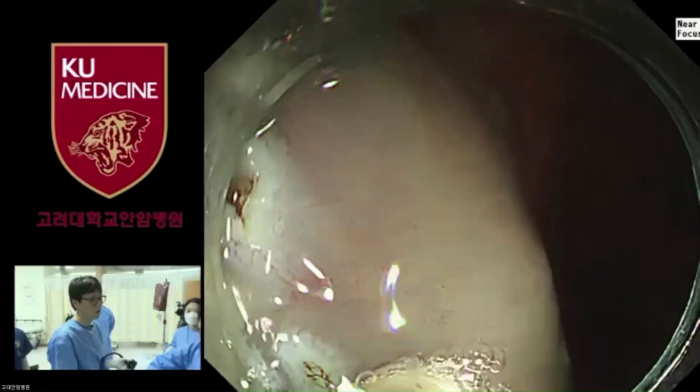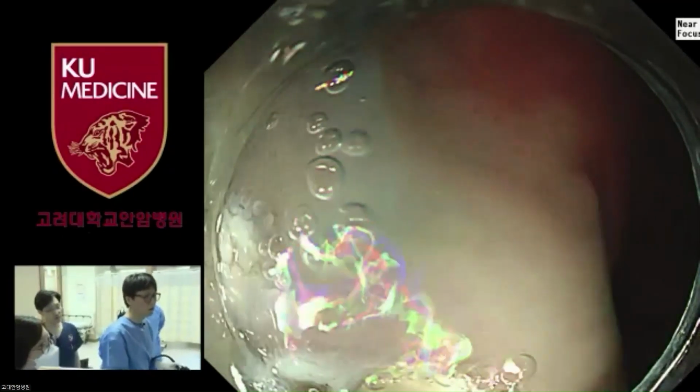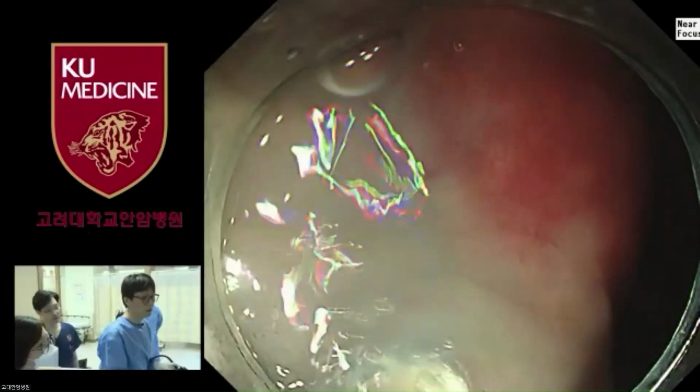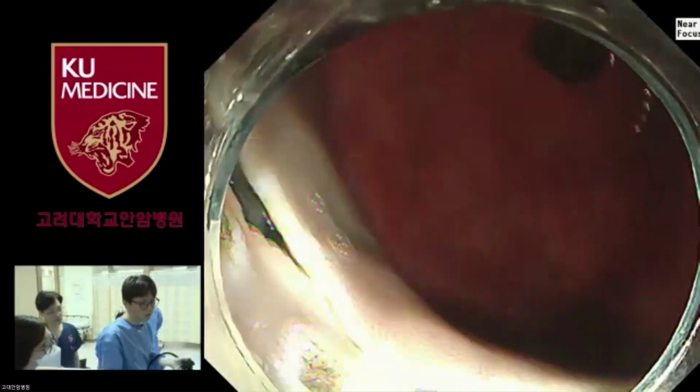So I guess you injected the lesion and you're doing all the incision because then you're going to use the robot. Is it correct? Yes, we are going to use a robot, but ESD has several steps.